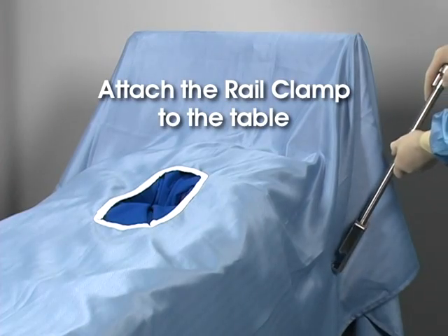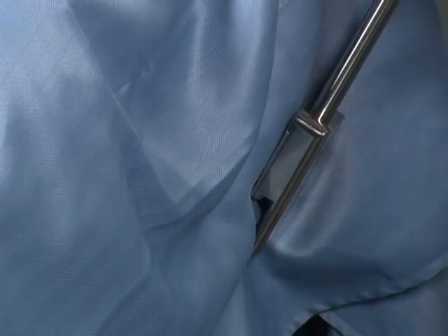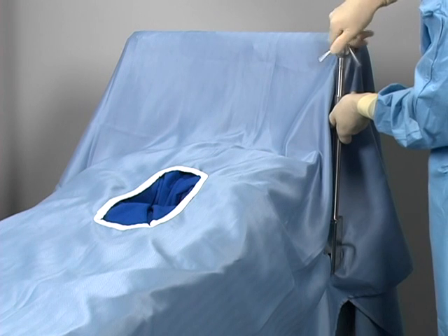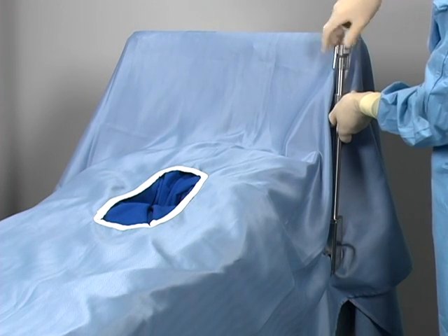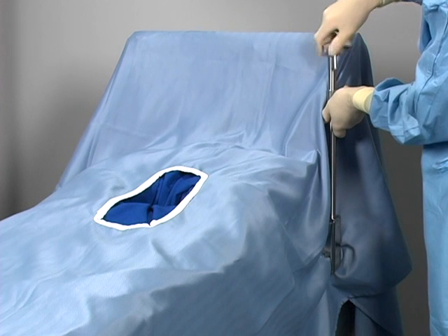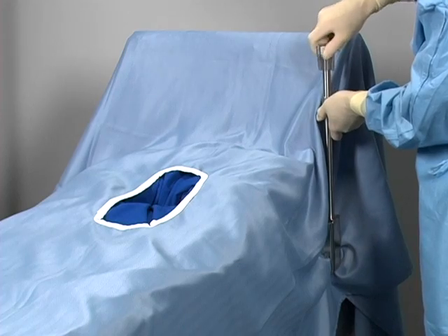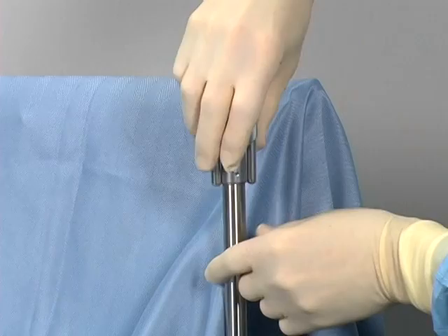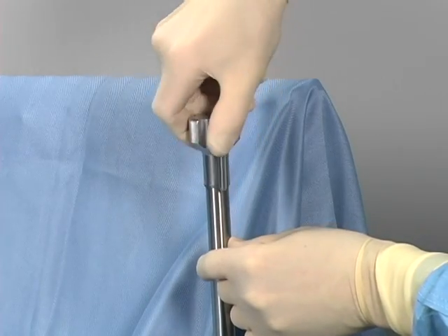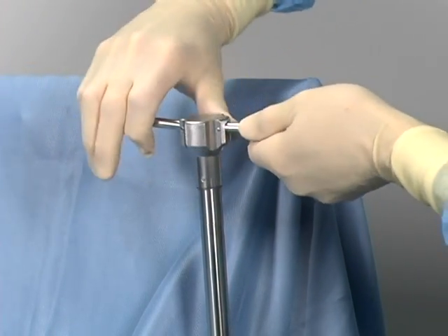Attach the Elite 2 rail clamp to the table. The Elite 2 rail clamp is secured to the table rail over the sterile drape on either side of the table, without having to break the sterile field. Offset the clamp to ensure maximum accessibility to the operative field. To attach the clamp, the lower jaw is hooked under the table's rail, and the top of the rail clamp is turned clockwise to secure it to the rail. Use the dog ears to give additional purchase.